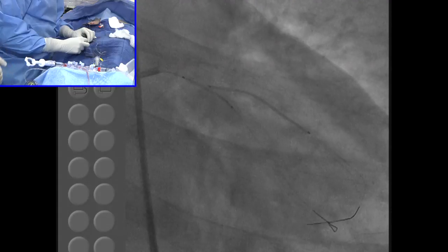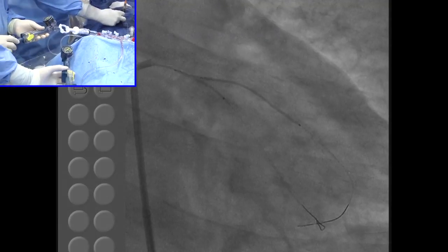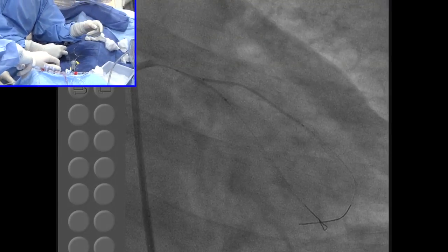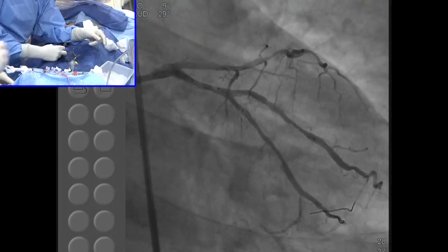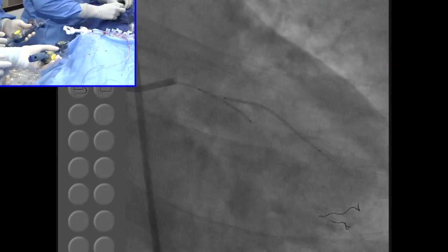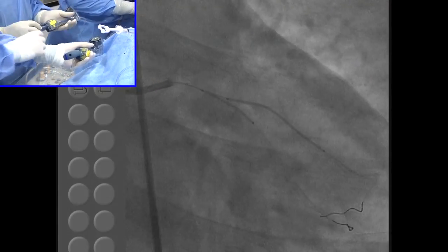Okay, good. So I think we are good with the placement. We just take a dry cine and then you give some dye. Don't give immediately, okay? First dry. Okay, now go. Yep, that's fine. Looks good positioning there. Yep, I'm going to go in a little bit with the side. I would just leave it. Okay. Yeah. Go up with the side. Who has the side? You are the main. Yeah, you are the side.